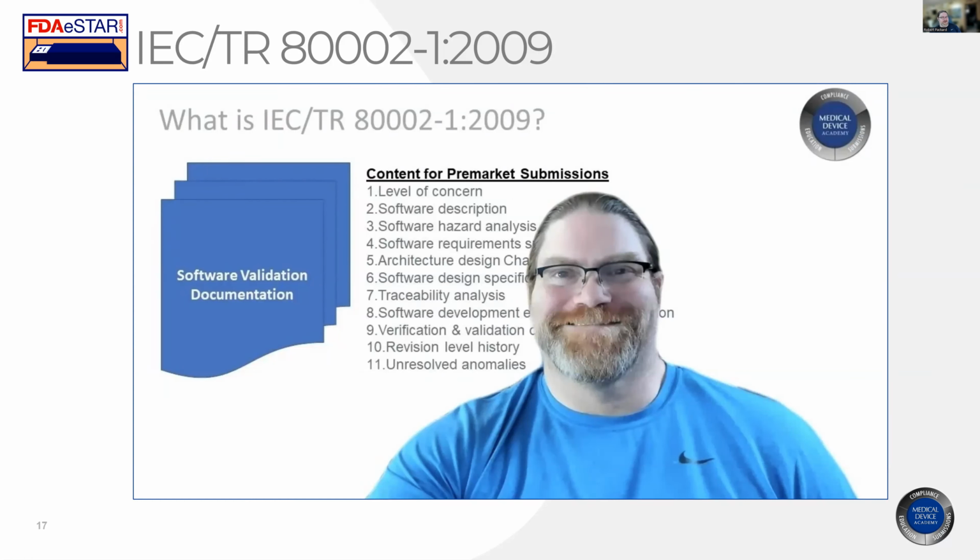So this is where you go, and it still says level of concern there because I did this before the 2023 came out, but otherwise, all the other items are still things that you have to provide. And we just substituted the basic and enhanced with levels of concern. So that may help you understand that particular guidance. That's the most current version of it. So you should really go to purchase that, and that will help you do your hazard analysis.